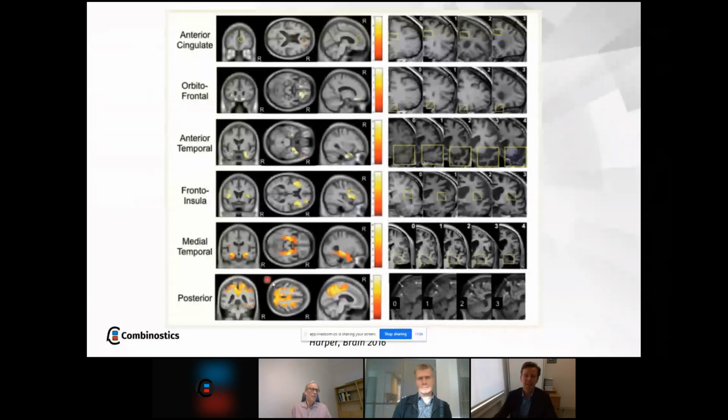Whereas the posterior cortical atrophy scale, for example, if you give a higher score, then the volume of gray matter really severely goes down in the precuneus and the more lateral parietal regions. The same is true for the medial temporal atrophy, which I'll discuss in a second. If you have a higher MTA score, you have a very specifically reduced volume of gray matter in the hippocampus and the surrounding structures. So the latter two are really very specific scales. They really capture the pathology well if you do a volumetric analysis.